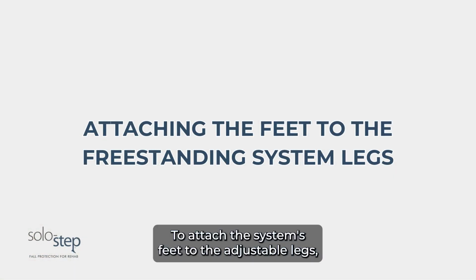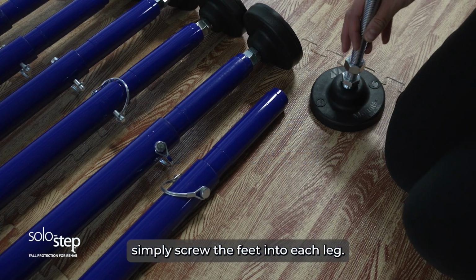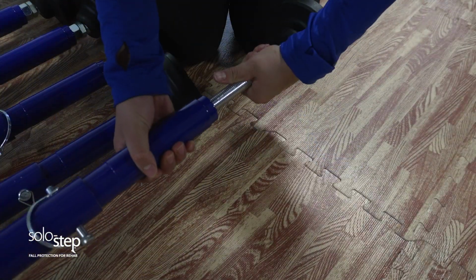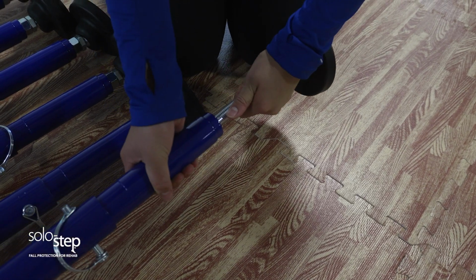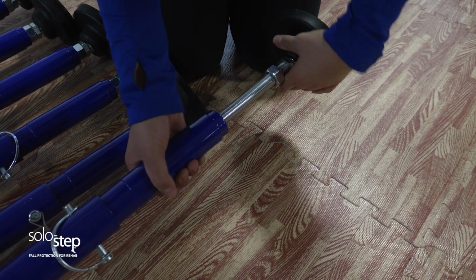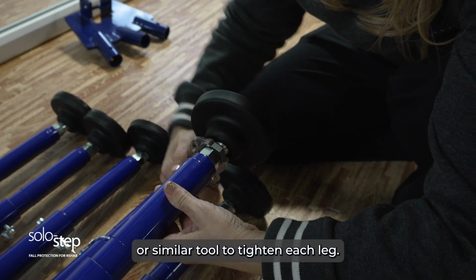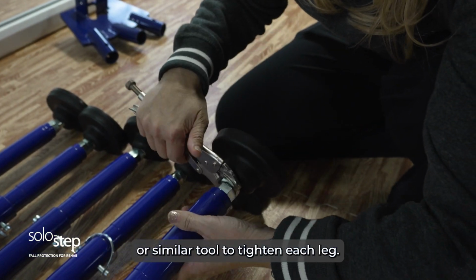To attach the system's feet to the adjustable legs, simply screw the feet into each leg. If necessary, use a wrench or similar tool to tighten each leg.